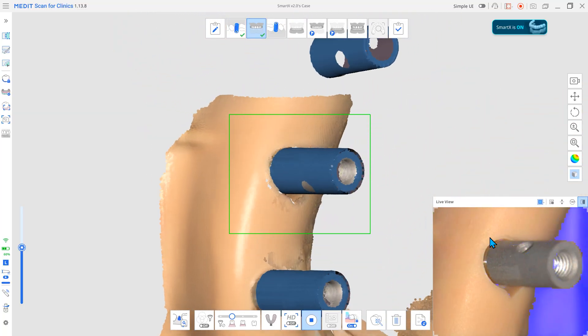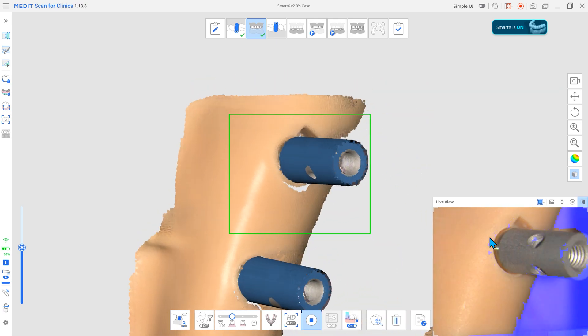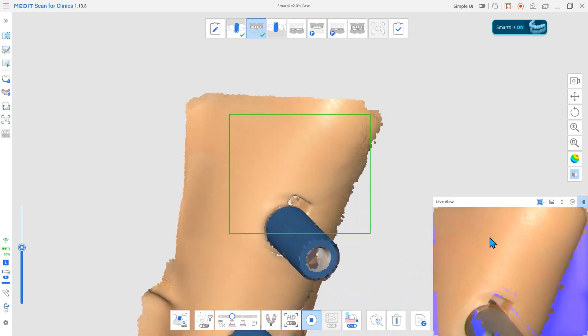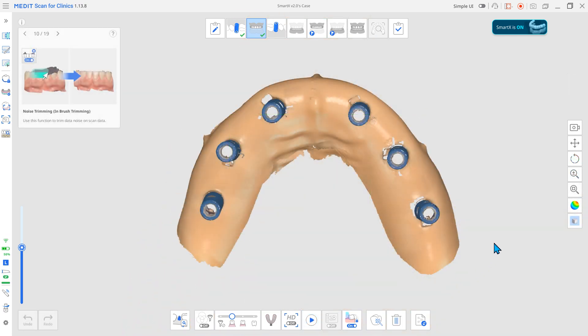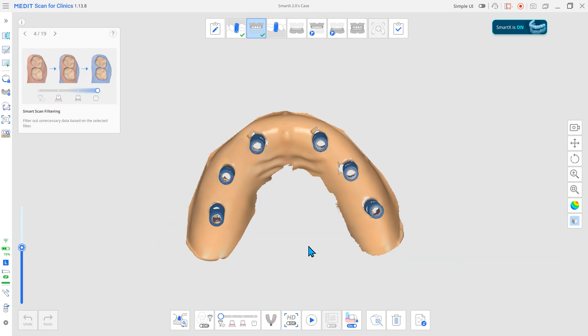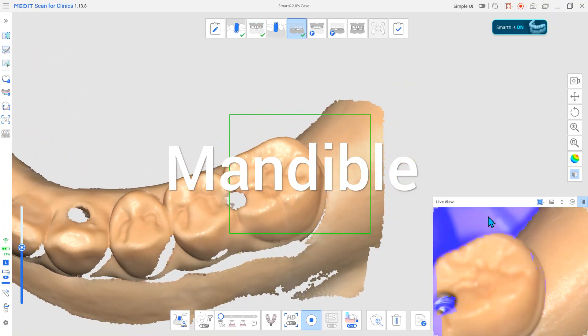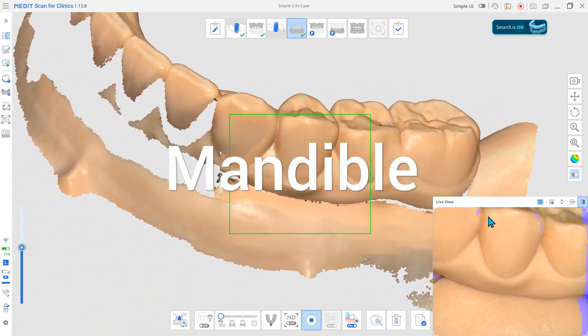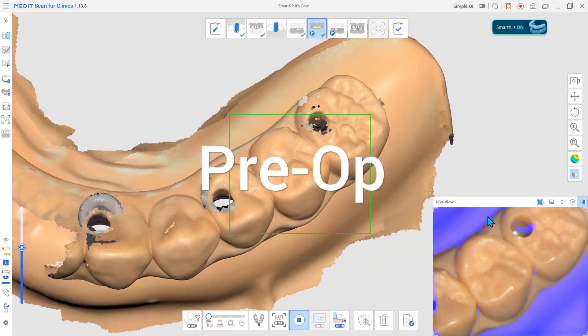The anchor cap serves as a reference structure, minimizing errors and making scanning easier. Next, follow the process to acquire any additional data as necessary.